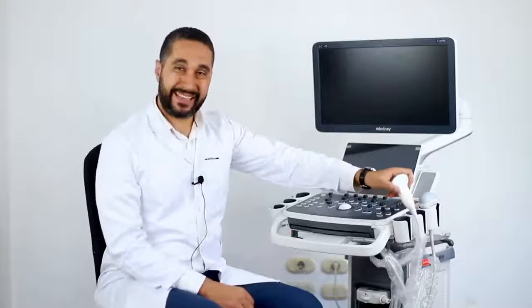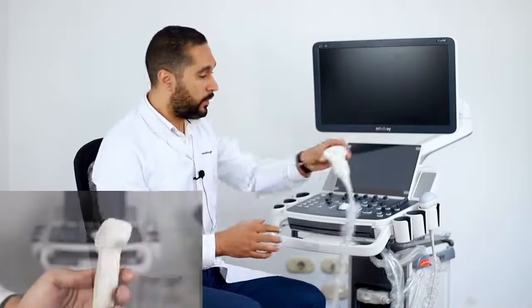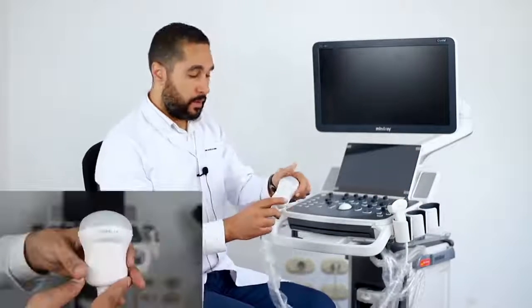With this machine you can do a precise, strong, and quick acquisition. The DC40 has the convex single crystal probe. This probe model is the SCC5-1N. We also have the 4D single crystal probe, the SCD8-1E.